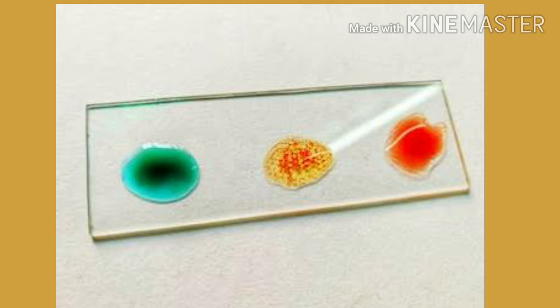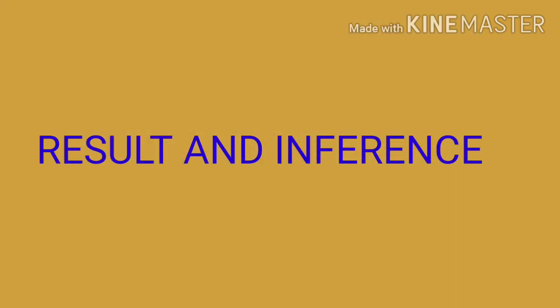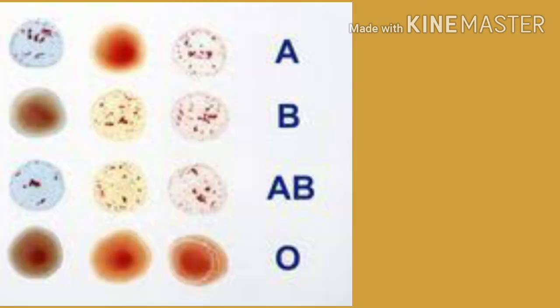In this slide we can see agglutination with the anti-B serum. For results: a person with A positive blood shows agglutination with anti-A serum and anti-RhD serum. A person with B positive blood shows agglutination with anti-B serum and anti-RhD serum. A person with AB positive blood shows agglutination with all three serums. A person with O negative blood group doesn't show agglutination with any serum.